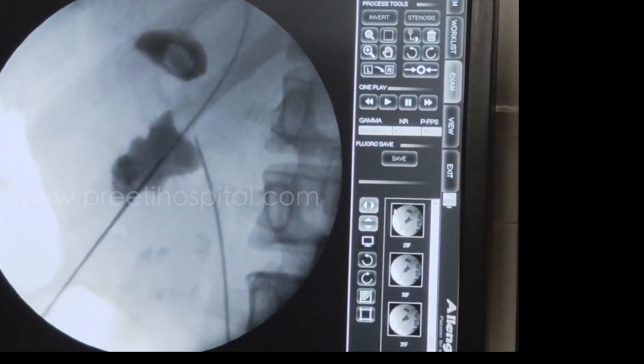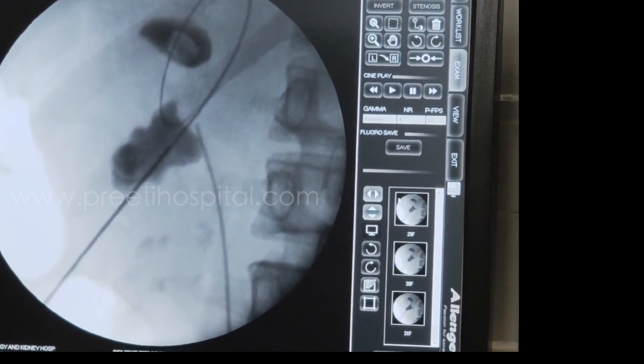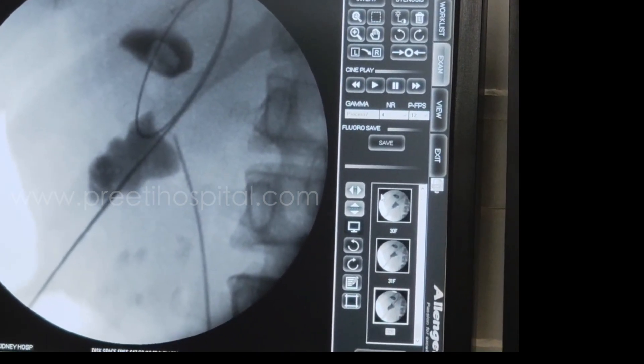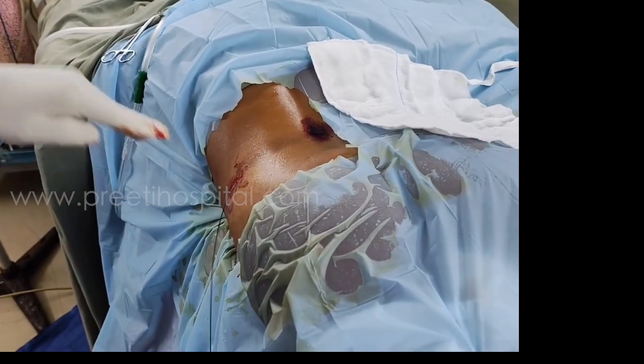But this may not always be positive. This is a dilated system, so the calyx has been entered easily. But for a very narrow calyx, sometimes to be more precise, you may take two angles also.